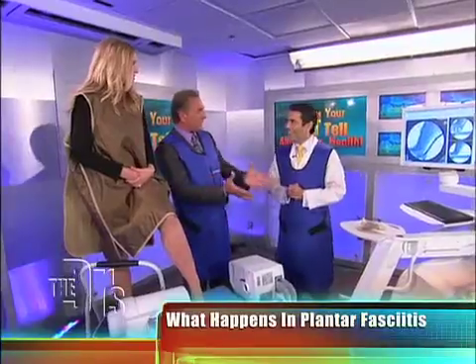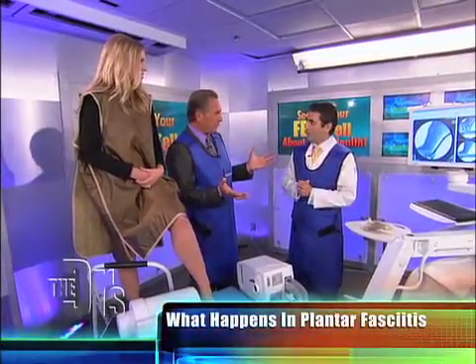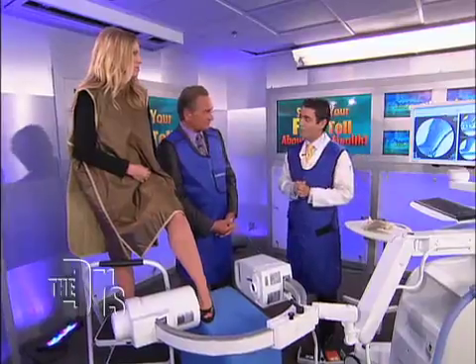Dr. Seidre, we're wearing the vest, but with this type of device, normally this is not an issue with radiation. We're doing this just for extra safety. The radiation that scatters from this machine is a very small field, so we don't actually wear these in surgery when we have to do surgery.